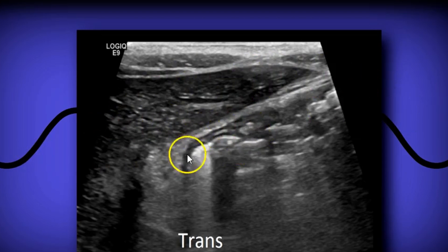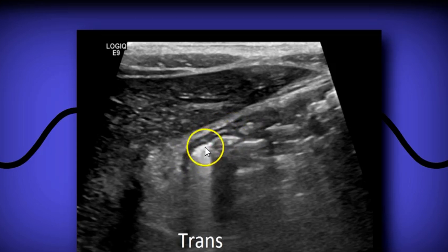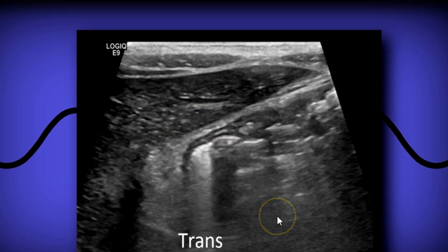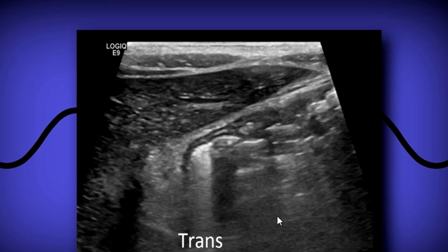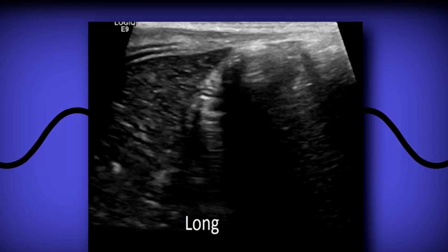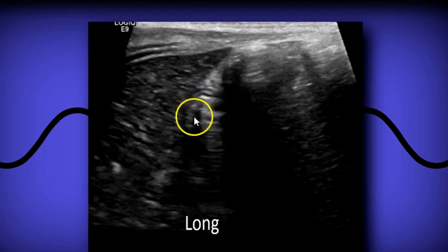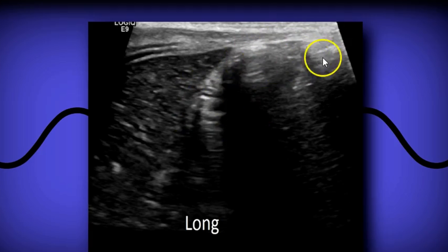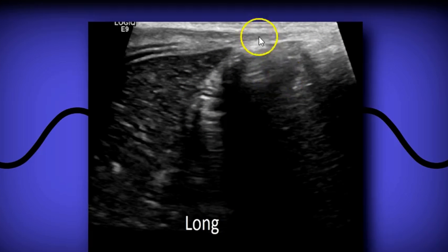Here's your antrum of the stomach meeting the pylorus with some gas. In this area you'll also find the pancreas. In sagittal, again you have the tip of the left lobe of the liver and the antrum of the stomach — a lot of gas in this area.